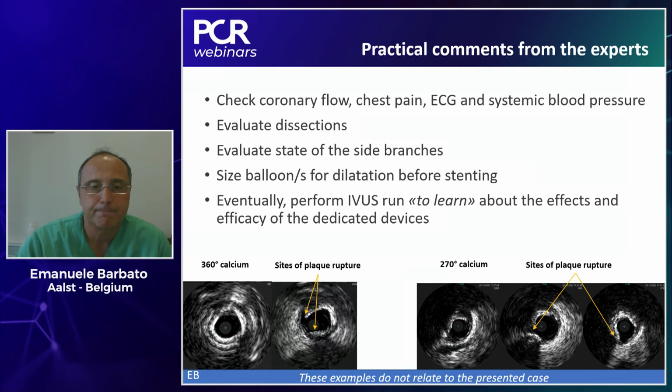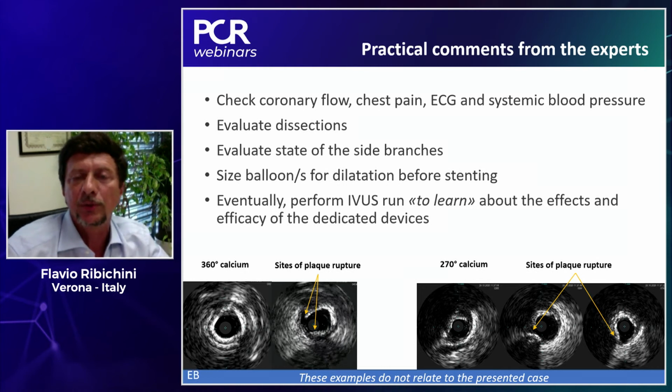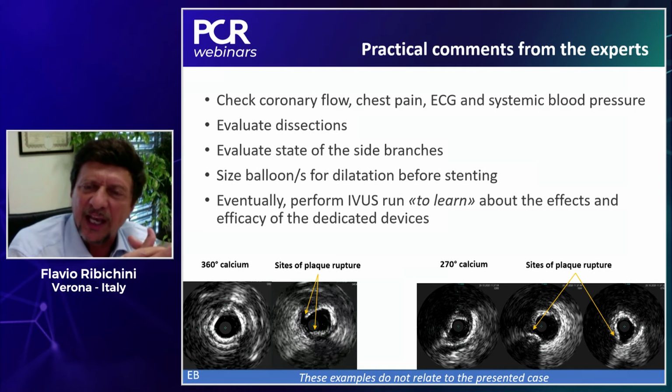I think at this point of the procedure, we are at a crossroad. You will see what we did, and you will see that there is no IVUS analysis after rotation, which I would recommend doing when you start using the technology, because you learn about what you see. And so how does it work? We said before, after rotational atherectomy, the stenosis looks pretty much the same. I mean, you don't see an enlargement of the MLD. It's a little bit disappointing.